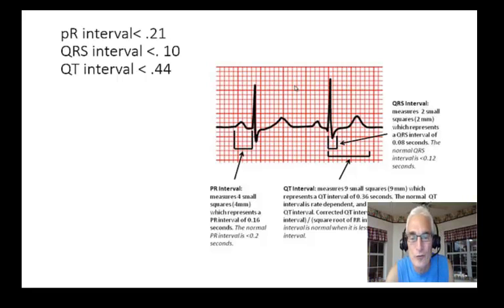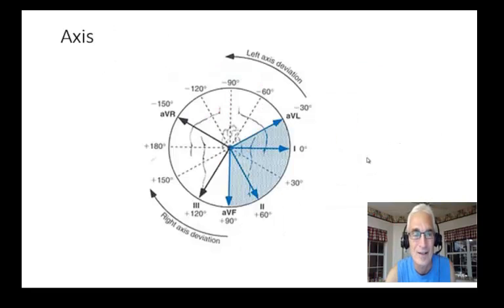Finally, the QT intervals. Look at the QT, that's that lower arrow. Beginning of the Q to the end of the T. Let's count. One, two, three, four, five, six, seven, eight, nine. Nine boxes times 0.04 is 0.36. Normal QT interval. Sweet. You're getting this down, I can tell.